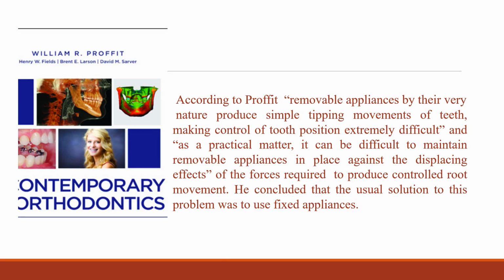Fixed appliances are the most popular form of appliance currently in use today because they can effect complex three-dimensional tooth movements in the management of many different types of malocclusion. Dr. William Proffit highlighted the importance of fixed appliances. He said that removable appliances by their very nature produce simple tipping movements of the teeth, making control of tooth position extremely difficult. And as a practical matter, it can be difficult to maintain removable appliances in place against the displacing effects.